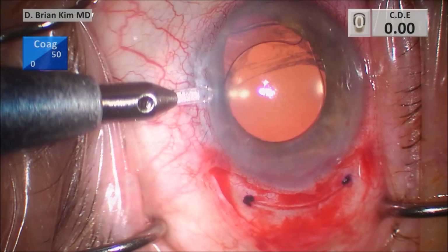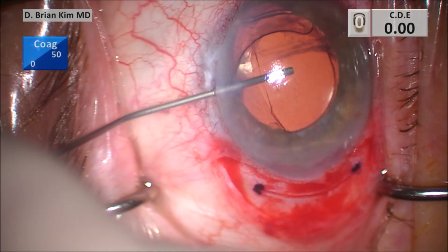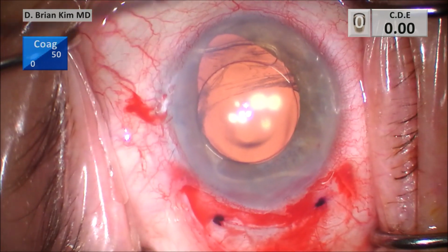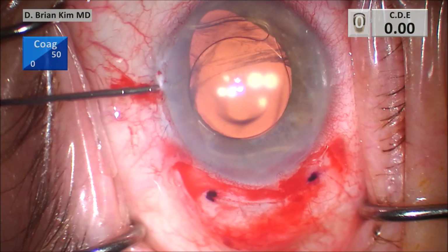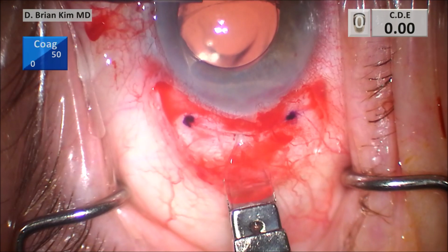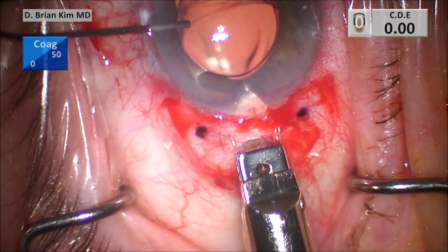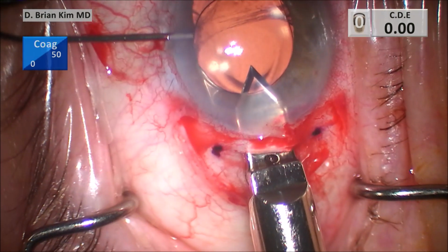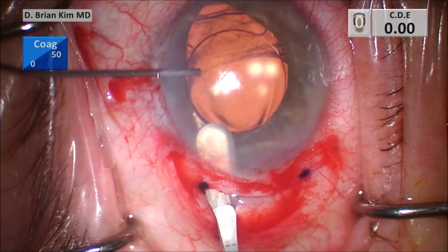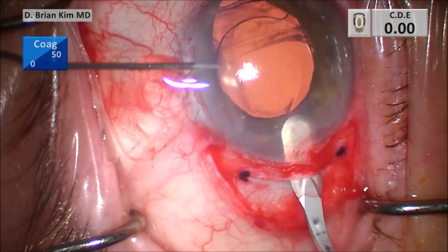So I go ahead and make my paracentesis incision, and then I'm injecting some dispersive viscoelastic. I place some dispersive viscoelastic within the incision as well. I do that because when I put my blade in, if I have that viscoelastic, it creates a little bit of a gap so that I don't create a second incision through the scleral shelf. Once I go in with the diamond, I go ahead and widen with the crescent blade. In that regard, the metal blade is a little bit better because it's less likely to create a second pass. You don't want to have 2 passes through your scleral incision.